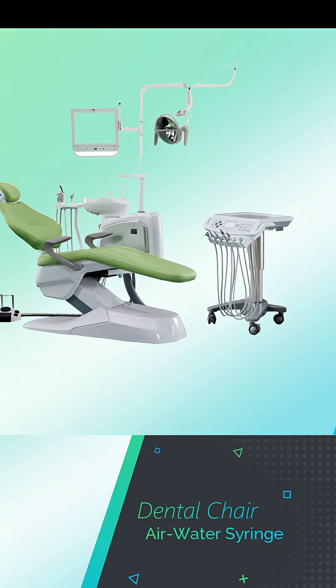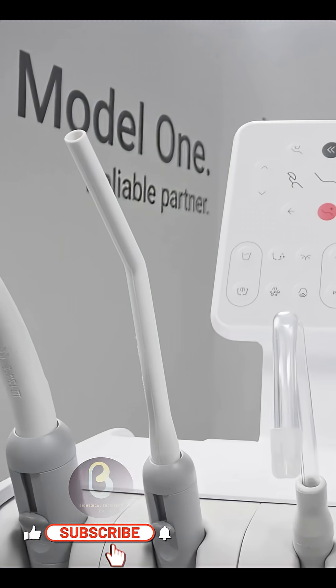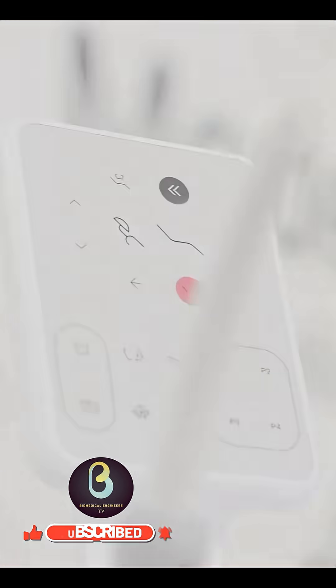The fifth component is the air water syringe. The air water syringe is one of the only dental devices that are used on every patient for every procedure. The two basic functions for this device are irrigating and drying.